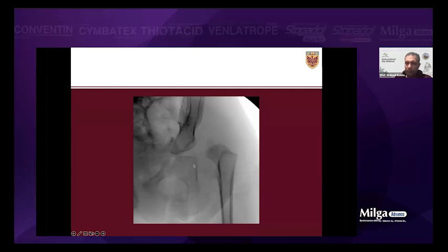Then I start to put my sutures for the capsulorrhaphy. As I mentioned, I use something called Orthocord, number 2. So I pass the sutures. The first suture is very far inferomedial. I get a very good bite. Even feel free to bite the bone as well. This will be the most important suture for you.